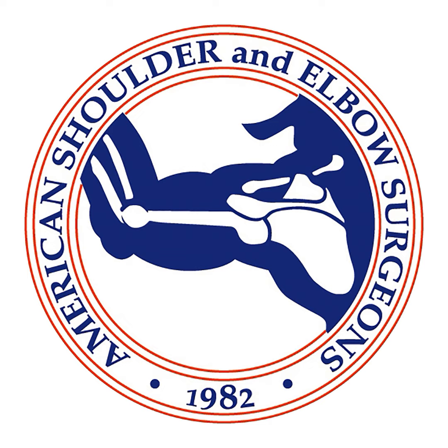However, recently, multiple patches have been released with applicators and newer methods of fixation that can make placement quicker. However, these patches are thinner, so it's unclear if they offer the same benefits that have traditionally been described with thick patches. So, in the backdrop of this changing landscape, we've invited two experts on to discuss the current indications and techniques for patch augmentation and rotator cuff repair.